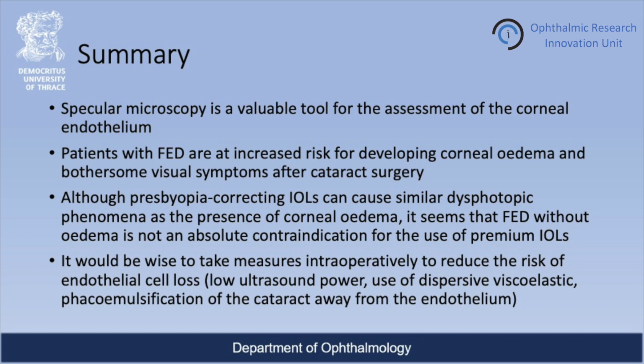Finally, it would be wise to take measures intraoperatively to reduce the risk of endothelial cell loss, for example, the use of low ultrasound power, the use of dispersive viscoelastic, and phacoemulsification of the cataract away from the endothelium.